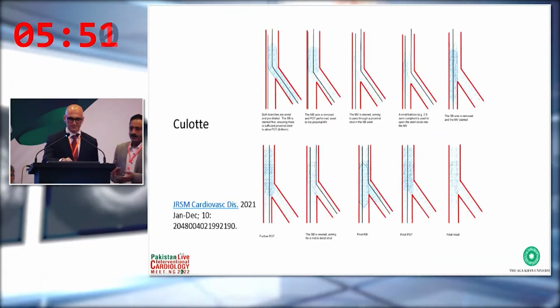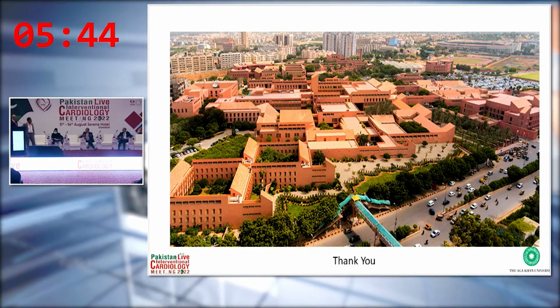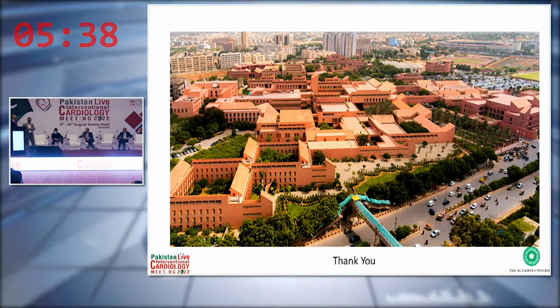What happens if you use a drug-eluting balloon before and then you do a kiss? I'm just wondering what happens if you do a drug-eluting balloon and then you balloon after that with a normal balloon. Does the drug go away? We try not to do it. In this case, I think there was no option because we didn't want to end with just a left main to LAD DCB. I think Rosli might have a better sense for whether we should balloon after the drug-coated balloon or just leave it alone.